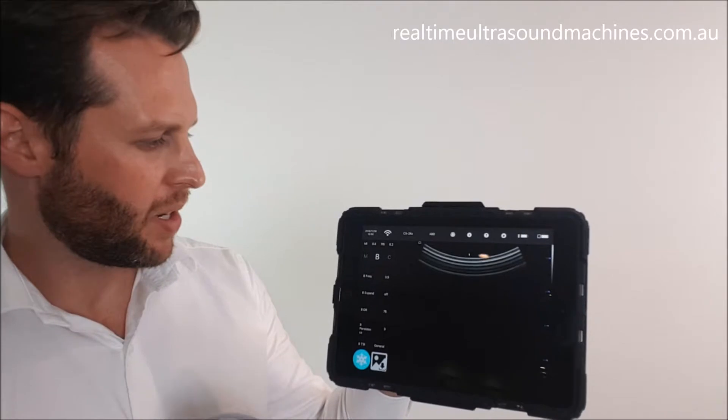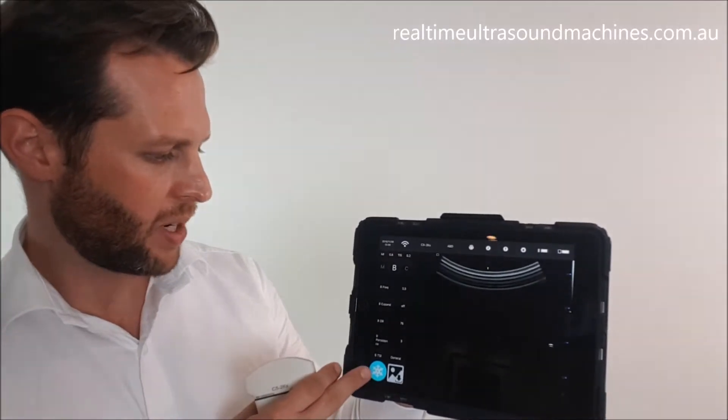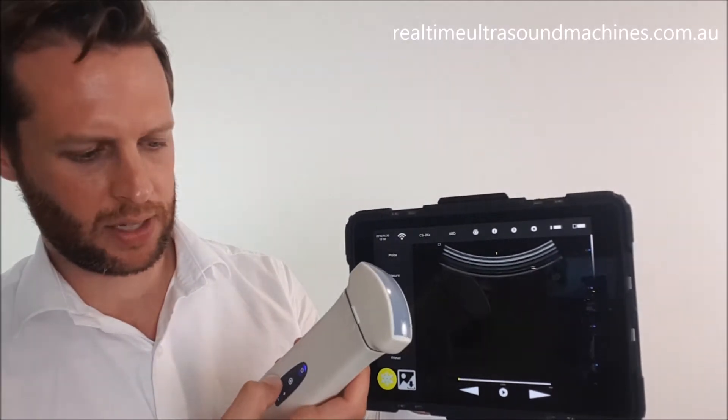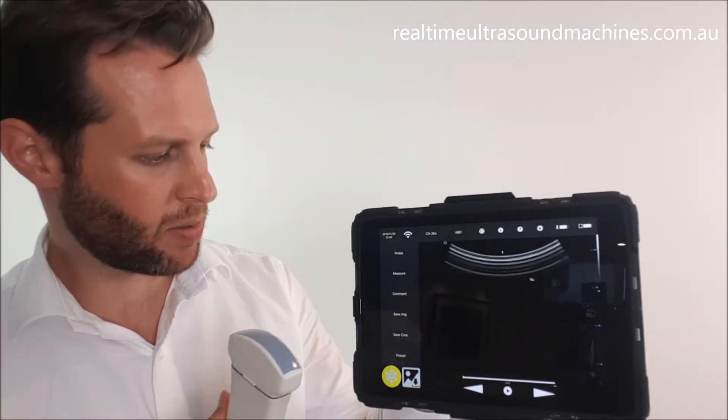If we want to do a measurement or add a comment, we need to freeze the image. We can do that by pressing the freeze button. Another thing you can do is use your ultrasound machine itself - if you're not able to reach the device, just press the power on-off button once and that will freeze it and bring up our menu. You can also use these buttons to select from the various menus.